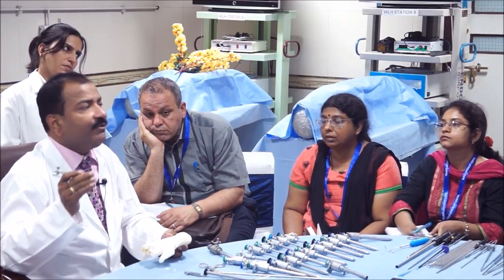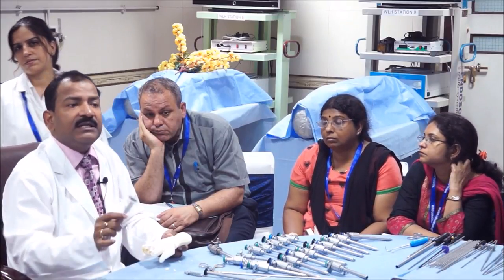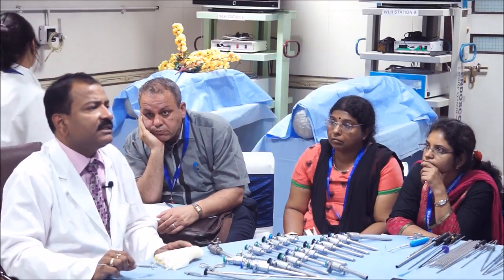But at that point, we know that blood has to come, because we already know by ultrasound that 1 liter of blood is inside the abdomen. So, this is how you have to do suction irrigation, hanging drop. Now, the next question is, what are the uses of the Veress needle?